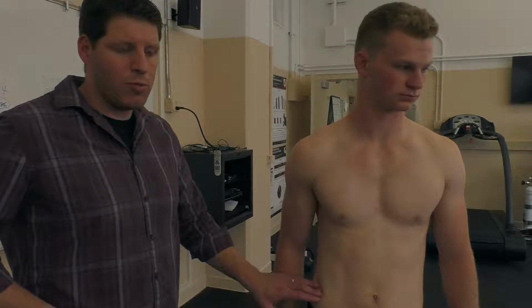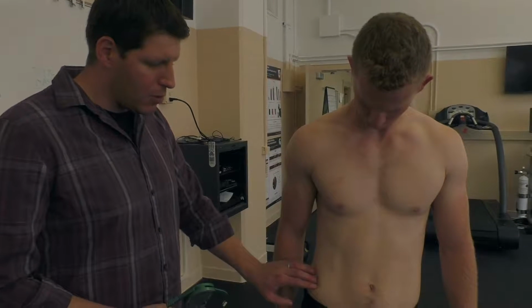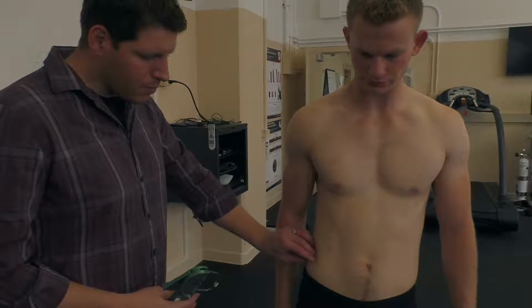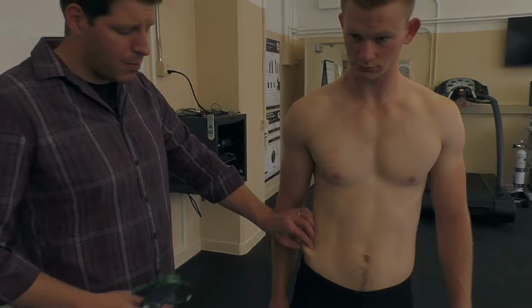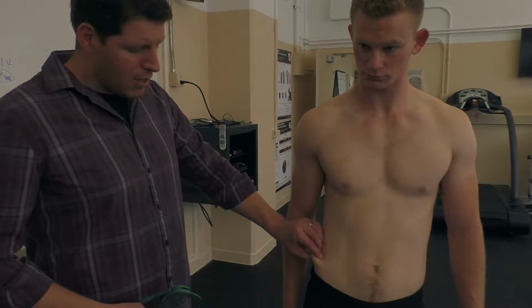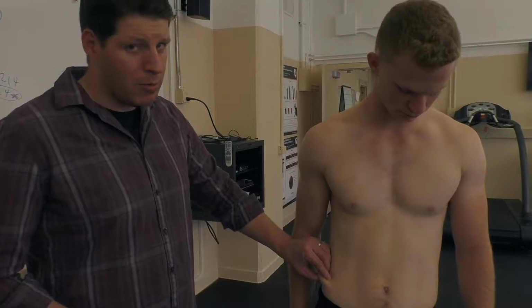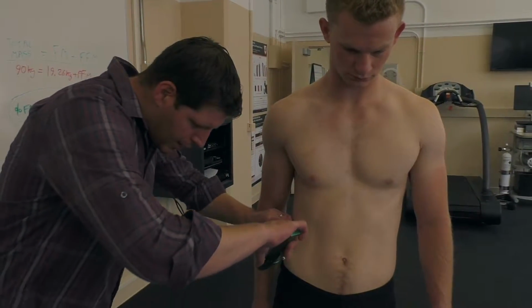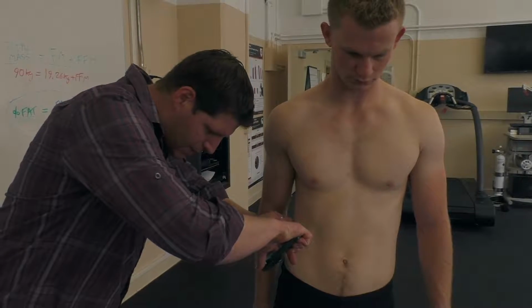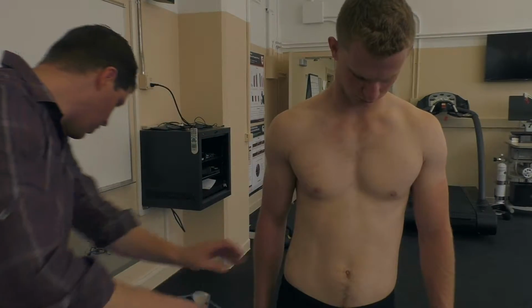Some are a little bit higher, some are a little bit lower, some stick out more, some are a bit more visceral. So there's some variability here, but once you find it, you're going to take the skin fold right at that area, right at the superior part of the hip there. As you're doing it, the fold is typically diagonal, but it's really just in line with the hip. So if their hips are a bit more forward, it may be more horizontal, for example. In this case, he's pretty diagonal. Again, you bring the caliper in, about 1 centimeter in between the caliper placement of the fingers, and you take your reading.